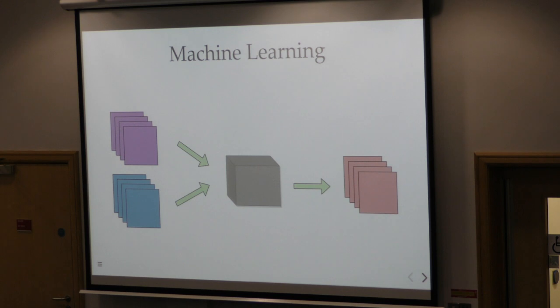So the way we do that is by getting the expert who would previously have been doing the segmentations for the purpose of creating a product to create segmentations for the purposes of training our algorithm. So we get a bunch of medical images and perfect segmentations, or assumed to be perfect according to our experts, and we feed them into our machine learning algorithm, whatever kind of algorithm it is, and we produce these red images which I use to represent segmentations which are near perfect.